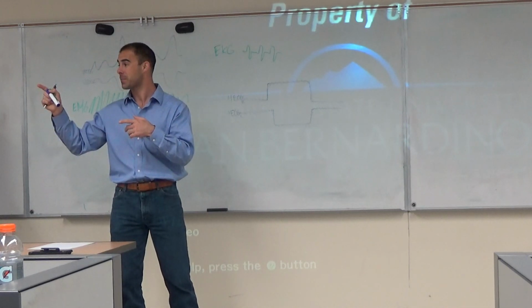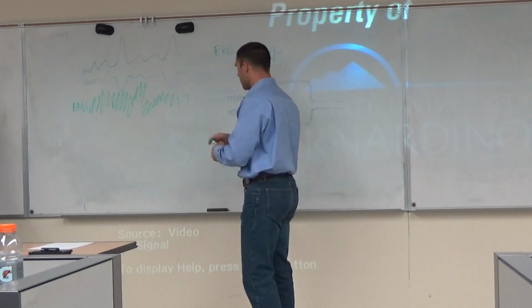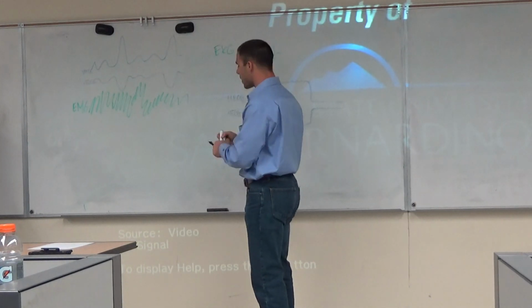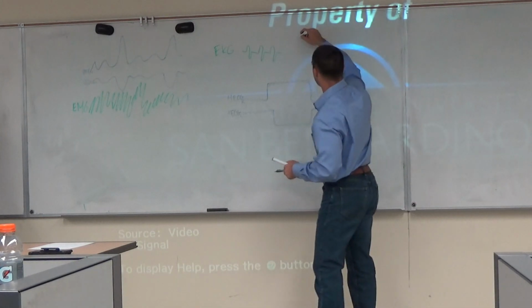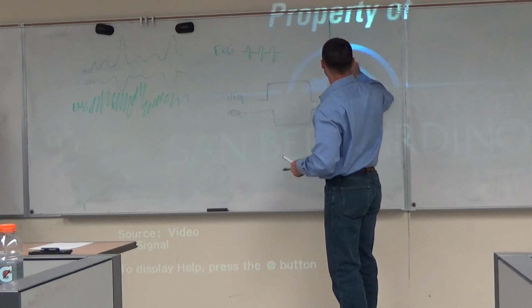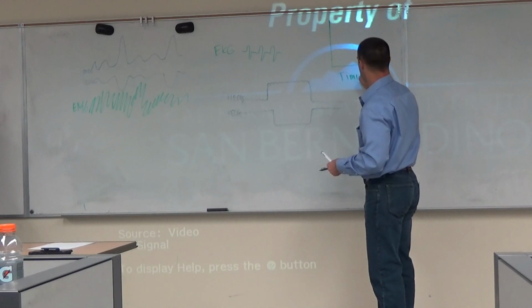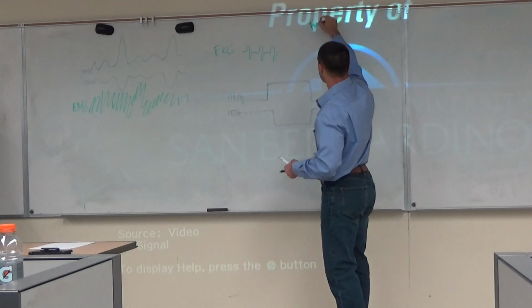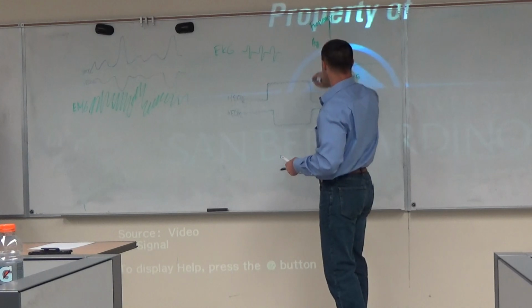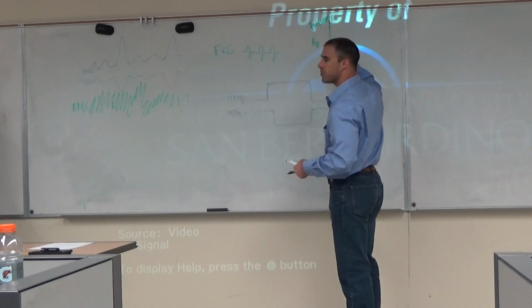Yes? I'm confused, what's alpha? Alpha is a frequency of activity. We talked about it a little bit last class, and it's in the text, but basically if you plot frequency over time, it's an easy way to conceptualize it, okay? So here's your frequency, and we measure that in hertz, okay? Just like any y-axis, you're going to have different values, right?